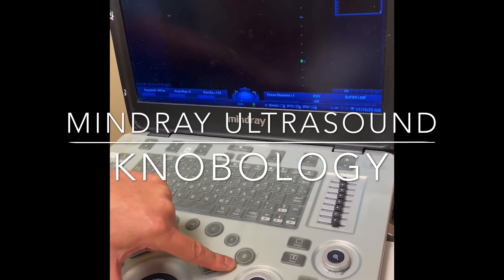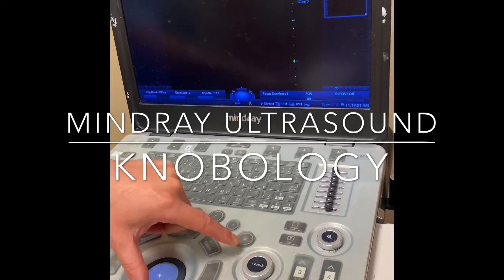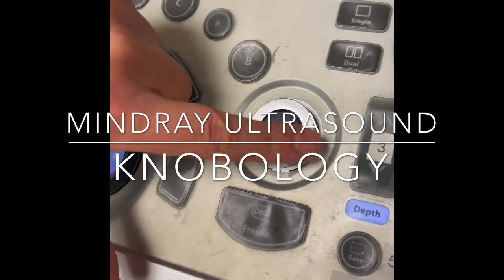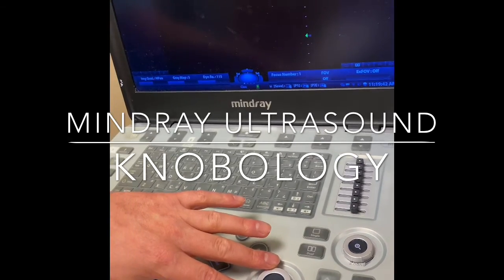While you're scanning, sometimes it might be necessary to adjust how bright or dark the images look. This is called the gain. You can rotate this knob to make the images look brighter or darker on the screen. This adjusts the overall gain.